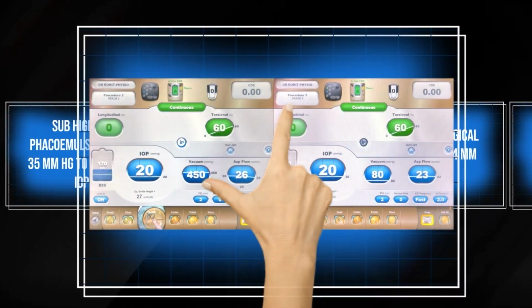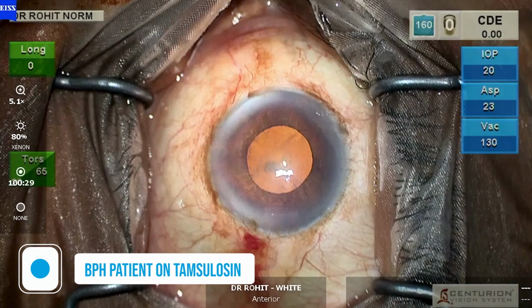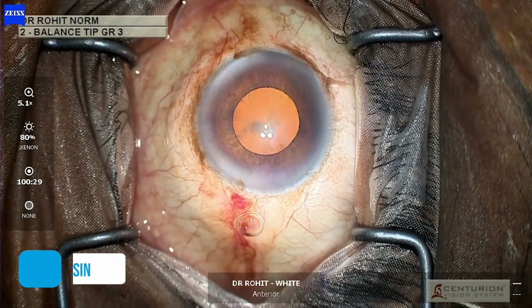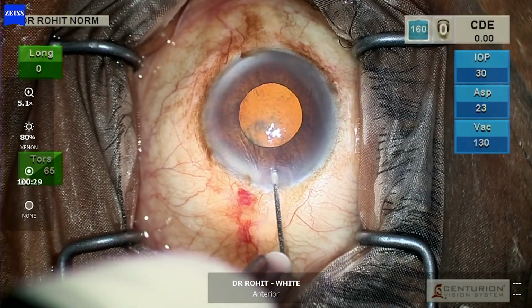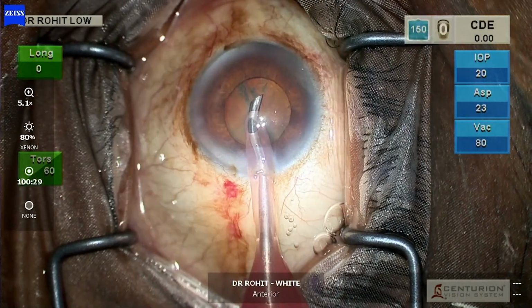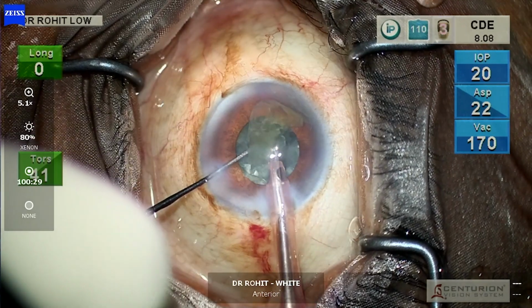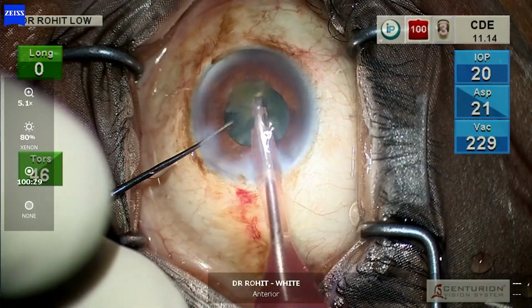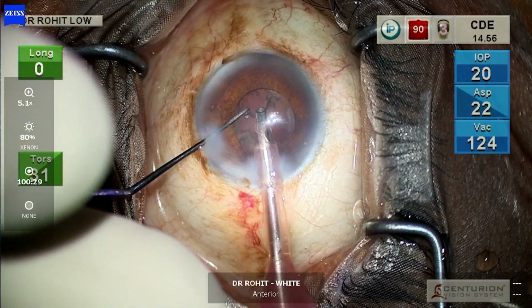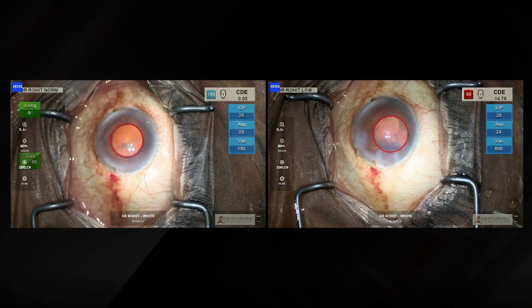I will be using physiological IOP in this patient on tamsulosin with 5.5 mm pupil. Side port incision calibrated to chopper is created. Epinephrine injected for dilatation. Irrigation off of handpieces while going in and coming out. Stable chamber settings with low fluidics helped decrease turbulence by reducing fluid streams and pressure variance in anterior chamber. Pupil size remained the same at the start and end of surgery.